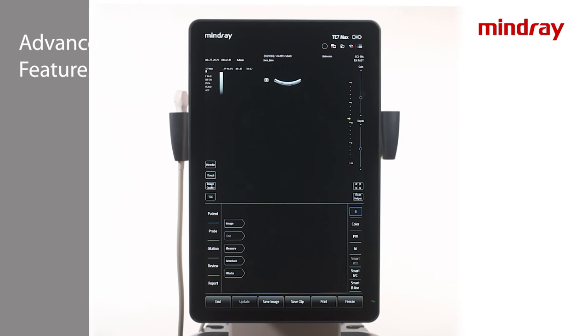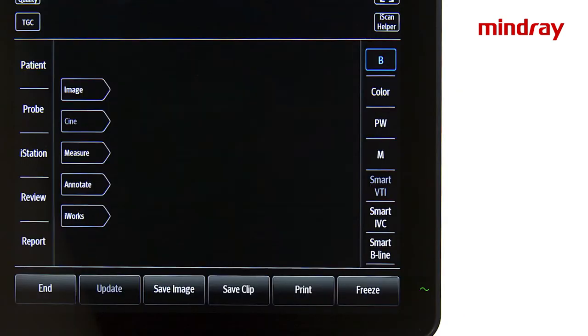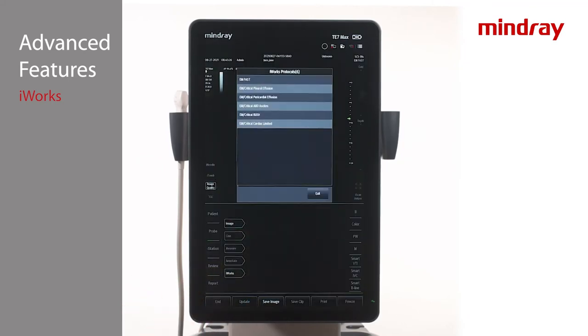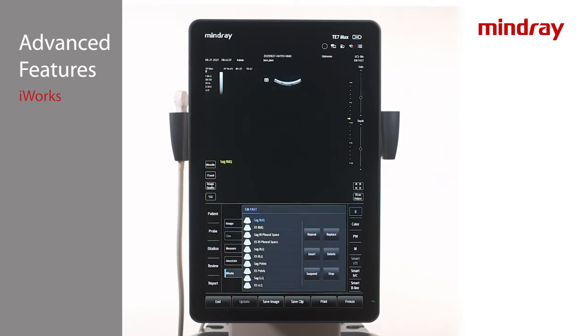The iWorks option is Mindray's protocol feature which allows for guided pre-labeled exams. iWorks is exam mode specific, so first choose your transducer and exam mode. To activate, tap the iWorks tab at the bottom center of the imaging screen. A list of iWorks protocols will display to choose from — tap the applicable protocol from the list. iWorks comes equipped with a large library of factory protocols, but custom iWorks protocols can also be created.